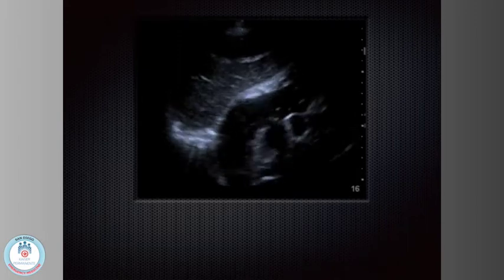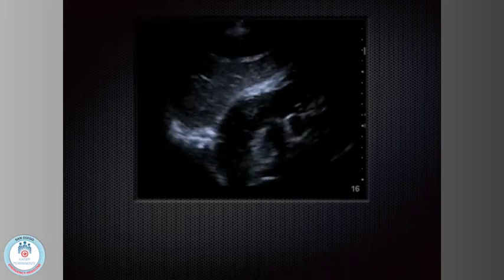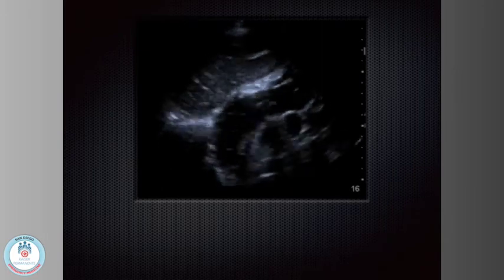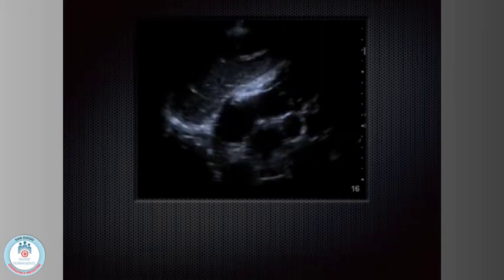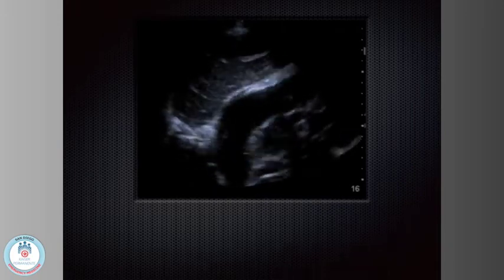I'm like, really? So, that's just regular normal saline. This is what it looks like in a subcostal view. You can see it in the RA and the RV. That's just pushing the flush in the line, and that's what it looks like. Super easy to see. You don't need color or anything fancy. It's just like those dots come in there.